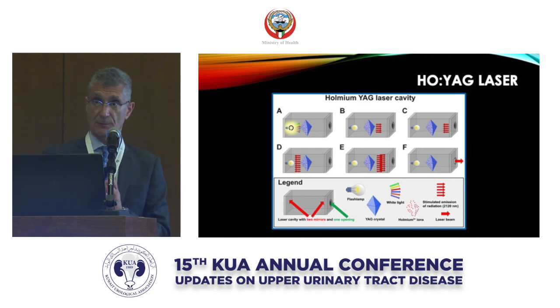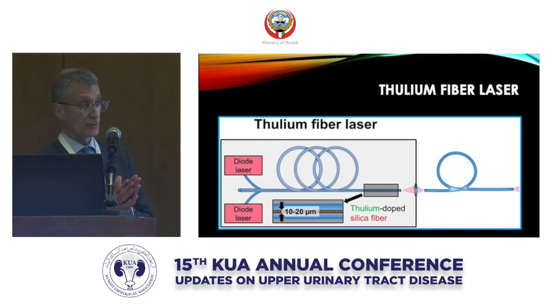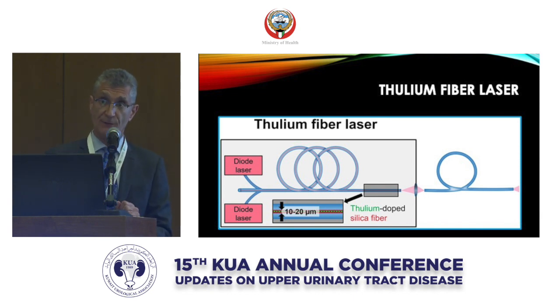And I think one of the very unique things about the thulium fiber laser is that smaller laser fibers can be utilized. So to address that issue, perhaps, of the lower pole stone and not being able to reach those with our conventional holmium laser fibers. There's one other unique difference between the thulium fiber laser, which is highlighted here in this slide, and that is the bottom panel, the pulse duration and the pulse profile. With the holmium laser, there is quite a bit of variation from pulse to pulse. So what that means is the effect may be somewhat different. As opposed to with the thulium fiber laser, you can see that square pulse duration profile, which means that the energy is much more uniform. So in other words, each pulse gives roughly the same amount of energy. And so that may be where some of the efficiencies lie with respect to things like quicker fragmentation of the stone.